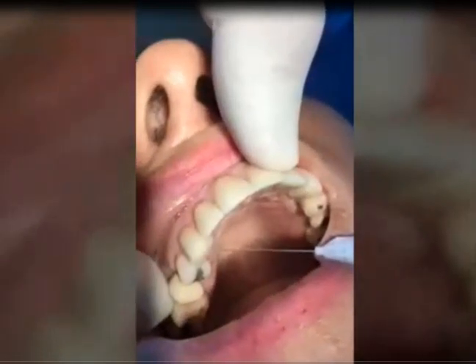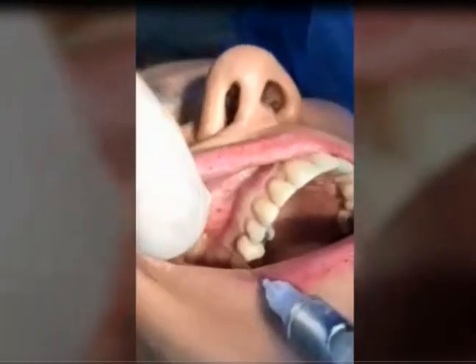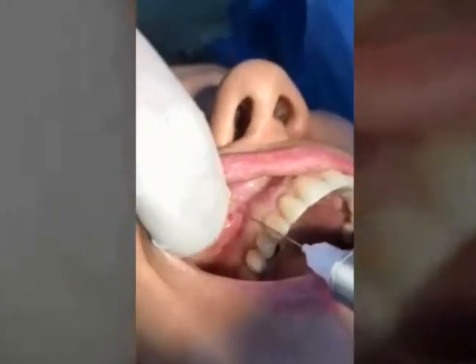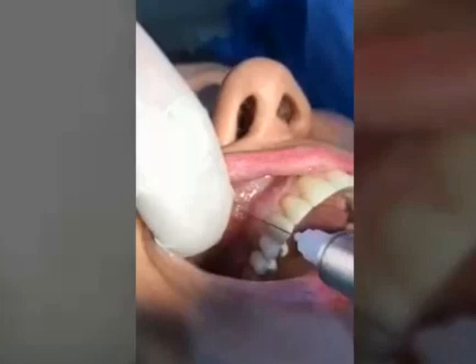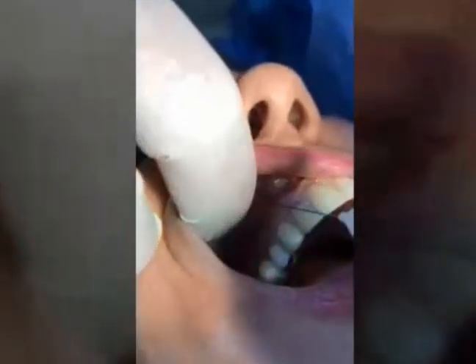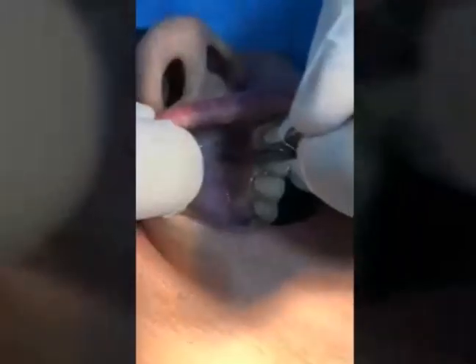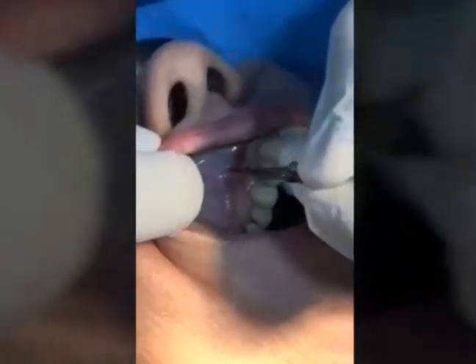Hello everyone, my name is Dr. Harem Jaffer. Today I will present a clinical case of replacing a failed implant and also placing a bone graft with platelet-rich fibrin, or PRF.